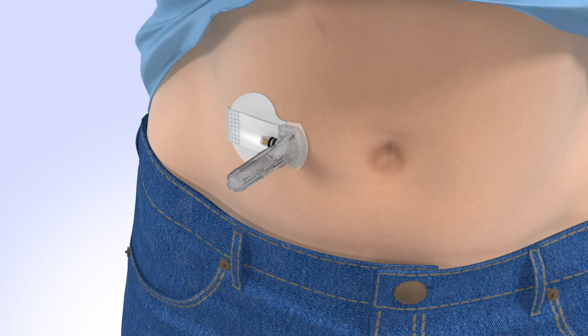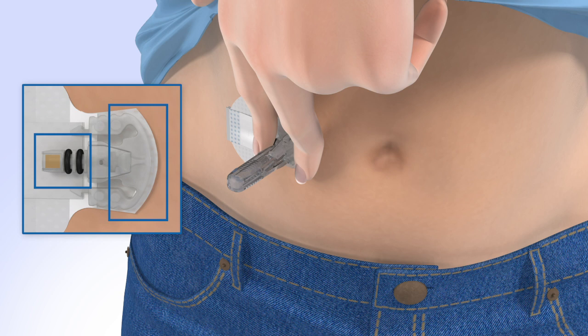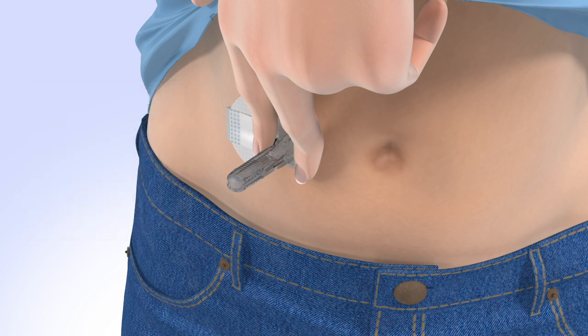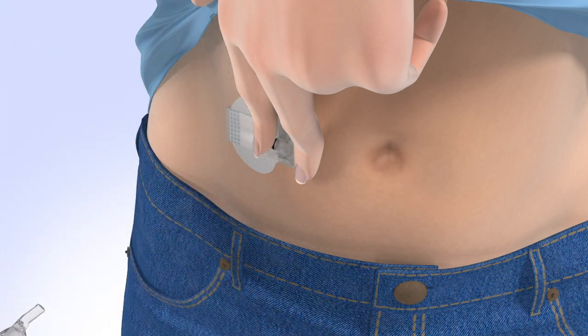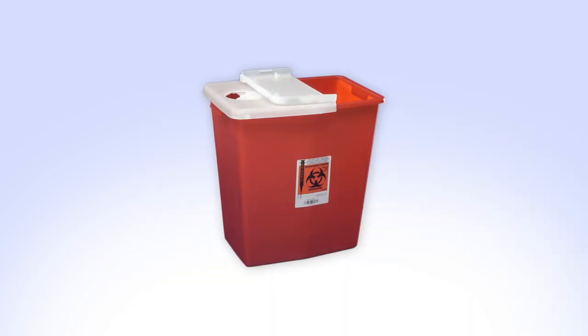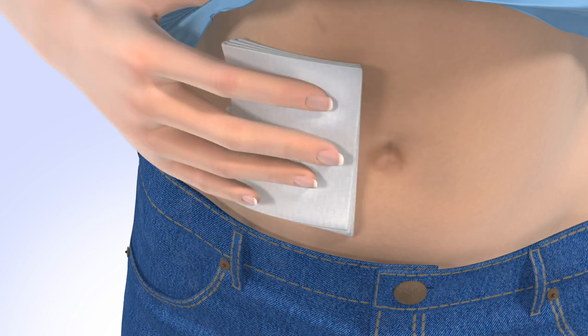Now you'll need to remove the insertion needle. If someone else is performing this step for you, please refer to the user guide for instructions. With one hand, gently hold the sensor by placing one finger on the front of the sensor and one finger on the sensor connector to ensure your glucose sensor stays in place. Be sure you do not hold or pinch the sides of the sensor. With the other hand, hold the needle housing at the tip and slowly pull straight out away from the sensor. The needle automatically retracts inside the plastic needle housing. Discard the entire piece into a sharps container. If bleeding occurs at your insertion site, apply steady pressure using sterile gauze or a clean cloth for up to 3 minutes. Please consult the user guide for what to do if bleeding does not stop.